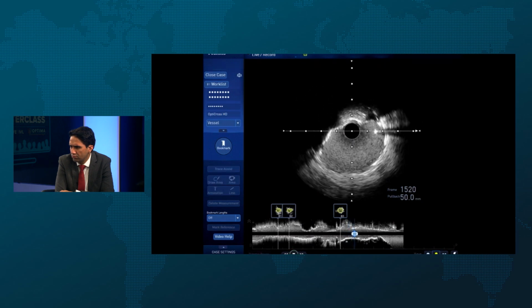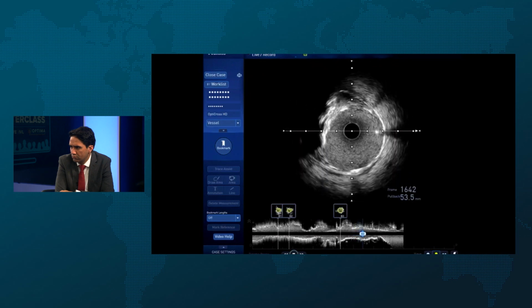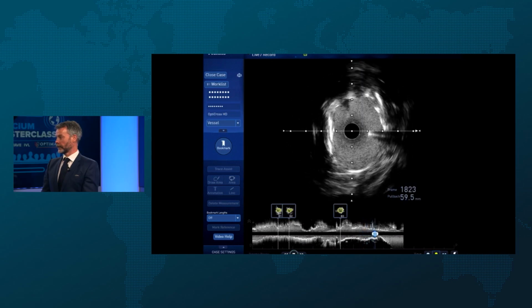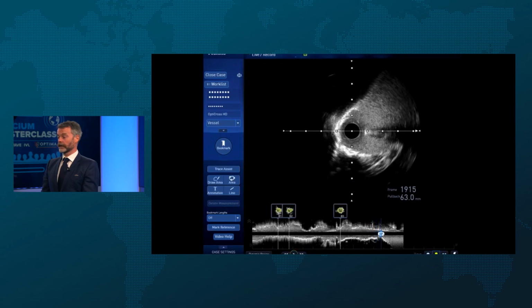Let's see what we think about that as we come through. It was underdone on the stent expansion, so we'll see what it is. You could see the nodule coming in then. No, that looks great. Still not bad though.